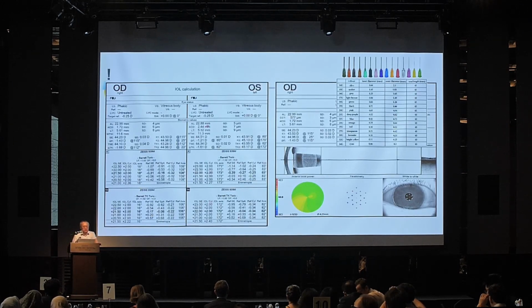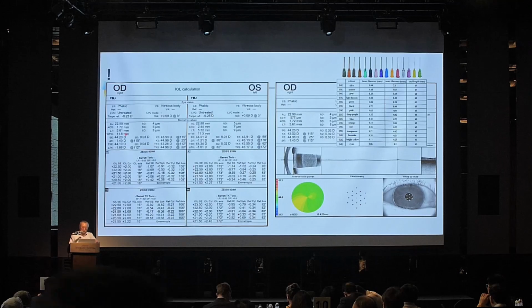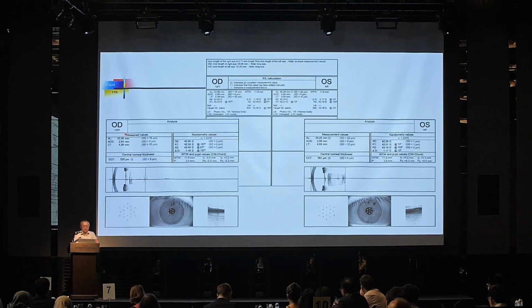Alright, and the lens thickness here is extremely thick, which means I do femto routinely, femto cataract. I've got to make sure that this patient's femto is going to use quite a bit of energy, and that the posterior capsule read by the femtosecond is consistent with the IOLMaster. You don't want the femto to cut too superficially or too shallow. So in this kind of patient, you may want to use more viscoelastic at the beginning to deepen the anterior chamber so that you can manipulate and do the necessary before you start phaco.